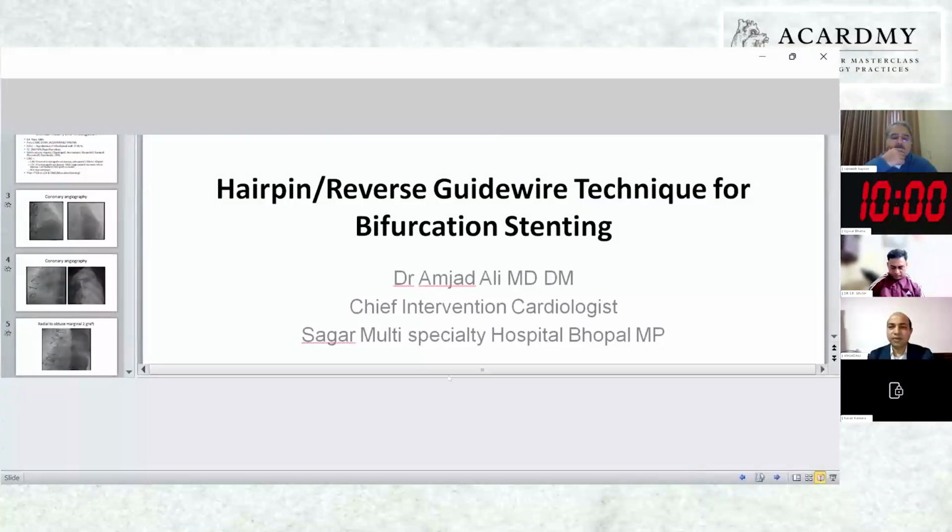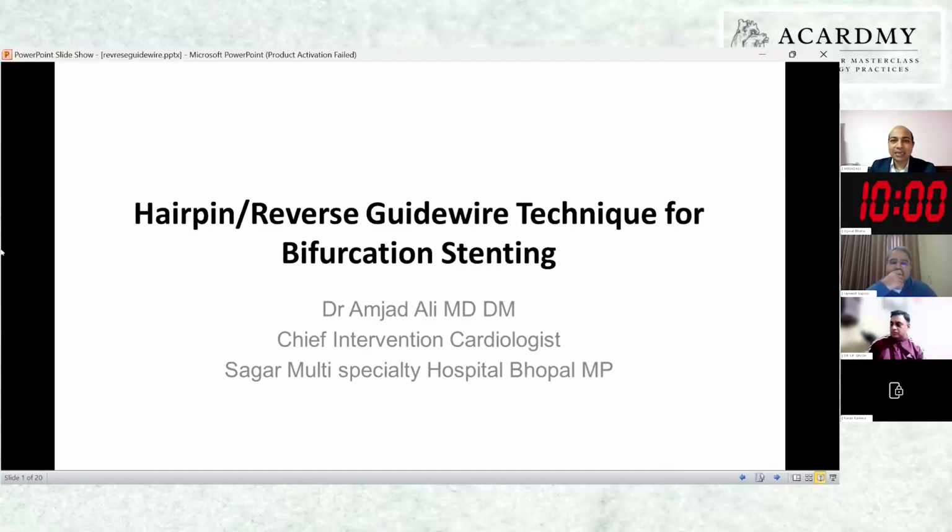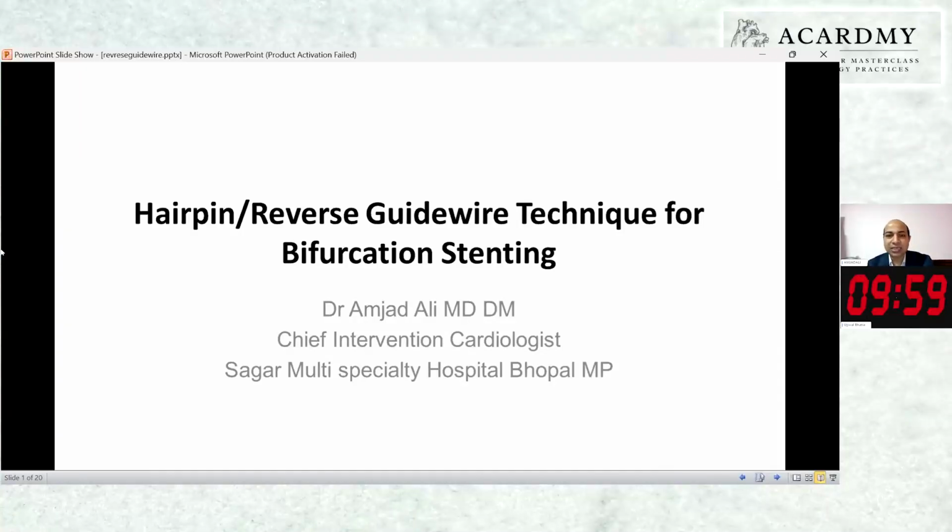So, very good morning. I'm going to present an interesting case of hairpin or reverse guide wire technique, which I used for bifurcation stenting. So, I'm going to show two cases.